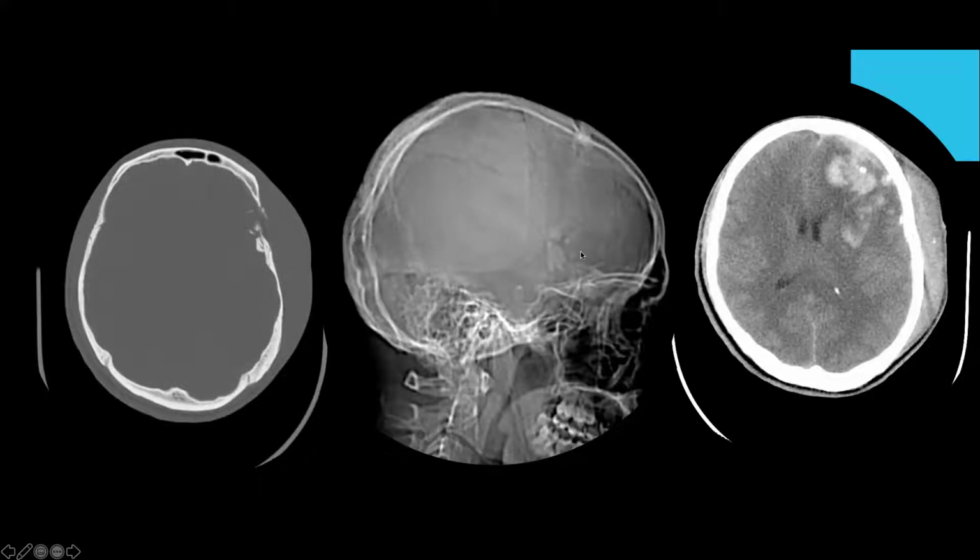So what has happened in this patient is there is a depressed fracture. Here are the fracture lines, and these are some of the fragments which are now evident on the CT because it's gone underneath the table, the outer table. And here are the associated intracranial bleeding with it.